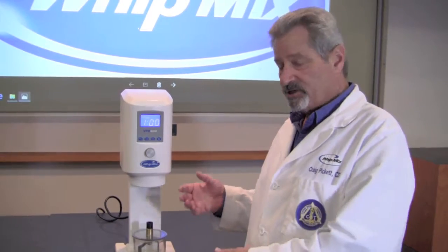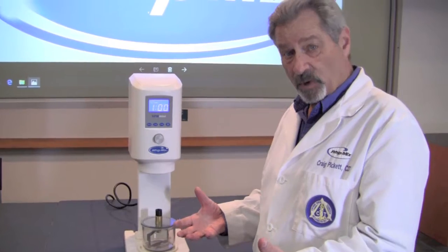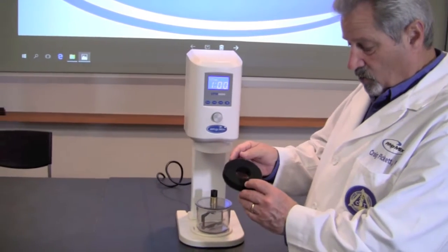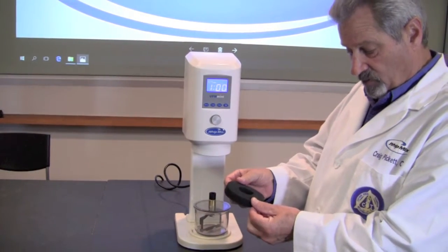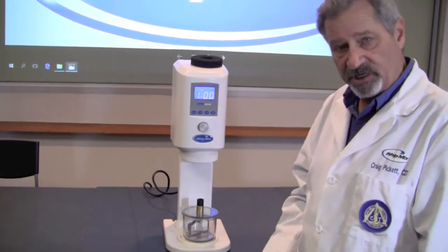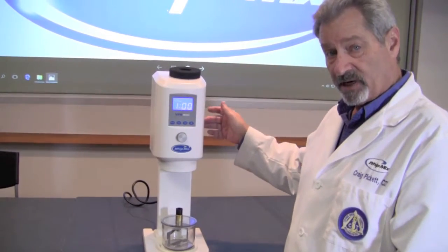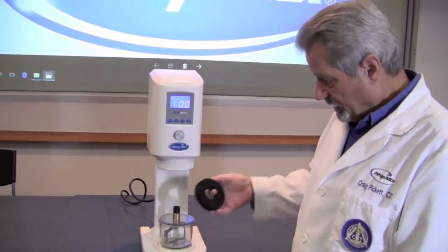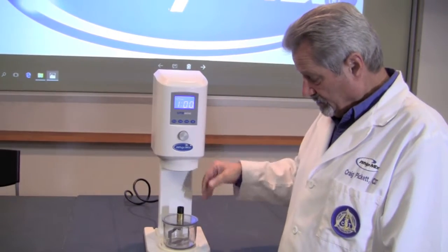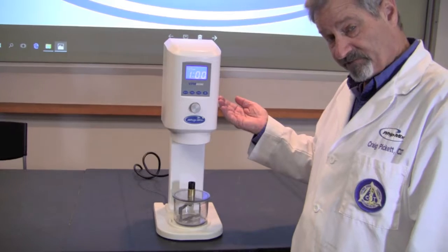One of the things we need to do with the VPM Mini is a little bit of maintenance, and you should do this every week. There is a foam filter right here in the throat of the machine — you want to remove that filter every week, wash it out, and set it on top of the machine to let it dry. The best time to do that is on a Friday when you're leaving the machine alone for the weekend. When it's dry it can be replaced into the throat of the machine, and it's there to protect the machine from any material from the bowl being pulled up into the machine by the vacuum.